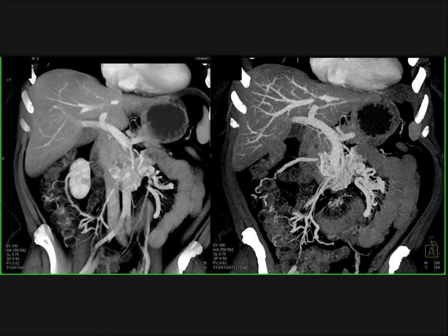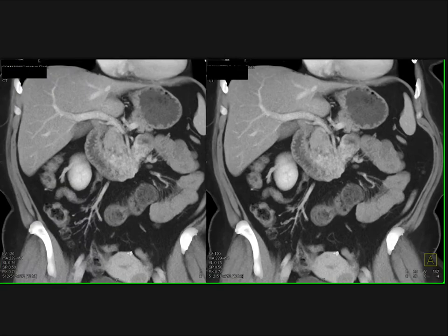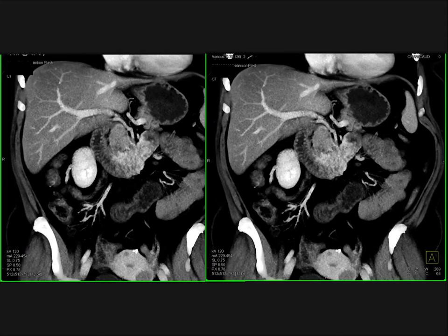If I go back to the tumor now, you see how the vascularity is. So now look at this example, same patient. You can see the tumors involving the 3rd and 4th portion duodenum. It's hypervascular. There's mass extending toward the pancreas. This tumor extending out. Just a very nice example. And again, these images do accentuate the vascularity.